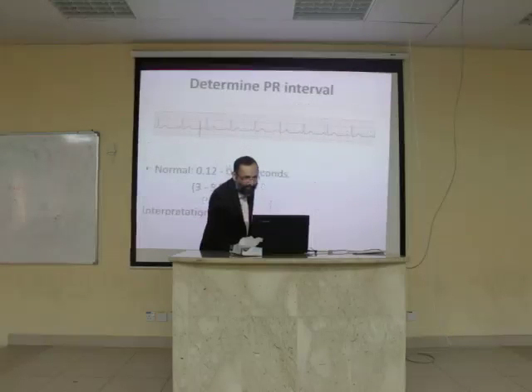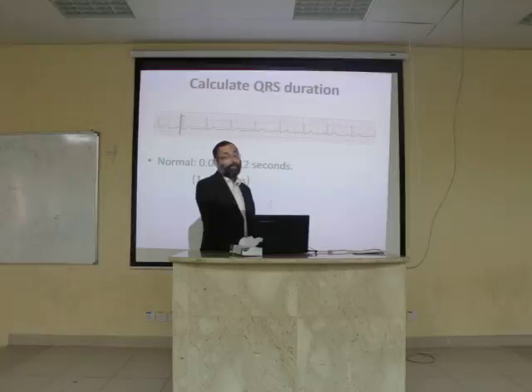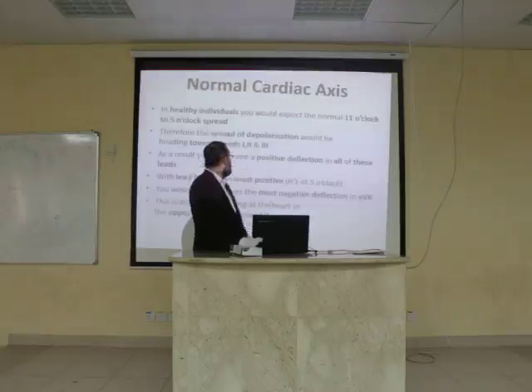You have to assess. Normal values. I am not giving you the normal values because it's written here. You have to see the normal values. What are the normal values of the PR interval, QT interval? If it is more than that value, it is abnormal.